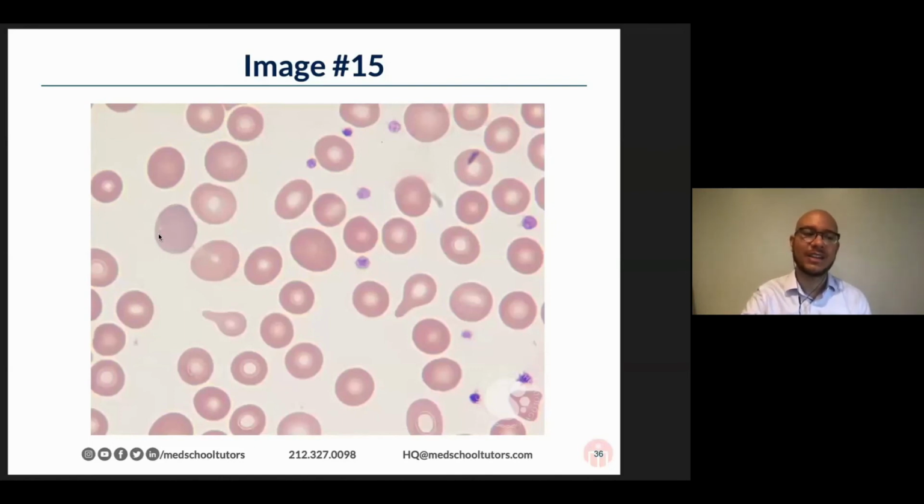This is a reticulocyte. So when people say, oh, the person is bleeding or they're having a ton of hemolysis, right? Let's check a reticulocyte count to see if their bone marrow is responding. That's what they're referring to here. And these other things look like platelets to me, by the way. So the major finding here is the dacrocytes.